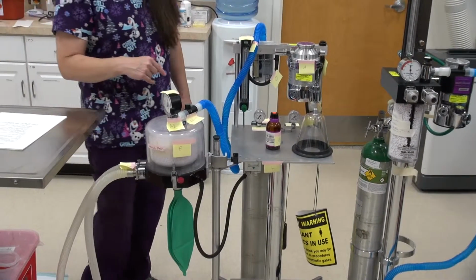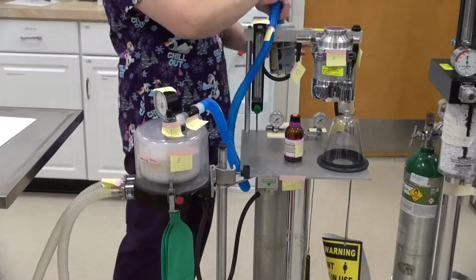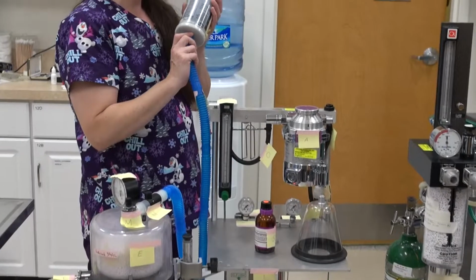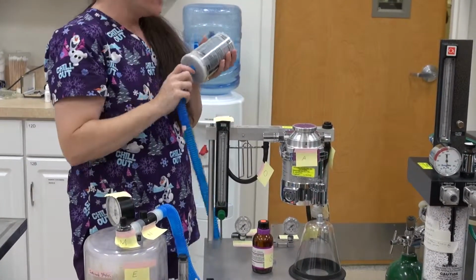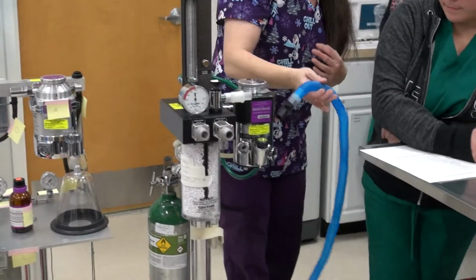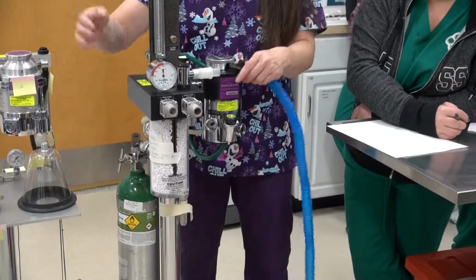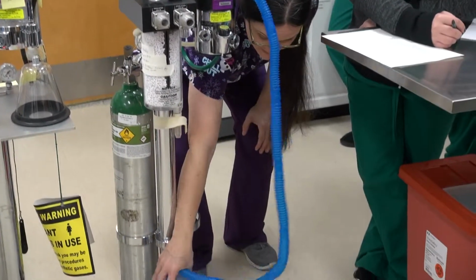We want to make sure our scavenge is properly connected. We want to make sure this tube is on tightly. We want to make sure we're attached to a canister if we're not in a building where there's a whole system throughout the hospital. We want to make sure that's connected. So same with this machine. We're making sure, see that was loose. We want to make sure everything's nice and tight. Make sure we're connected to a canister.